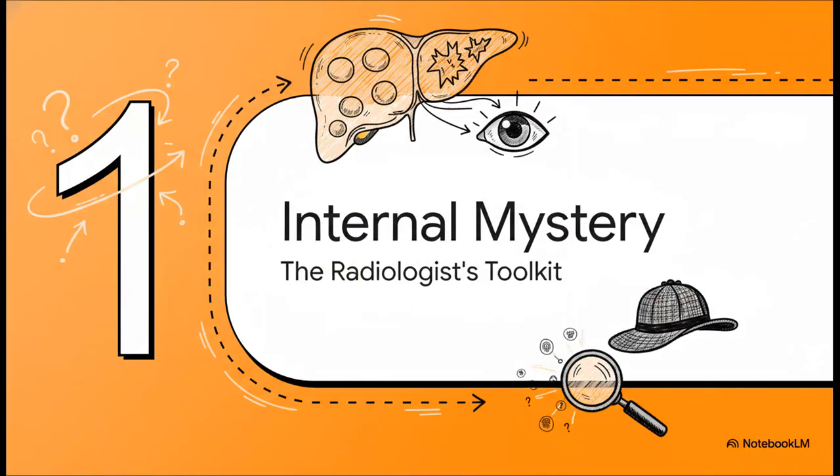You know, to solve any mystery, you can't just wing it. You need a system. And radiologists, they definitely don't guess. They have this really methodical way of figuring out if something is harmless, what they call benign, or if it's something more serious, malignant. It's all about gathering the clues and knowing how to read them.